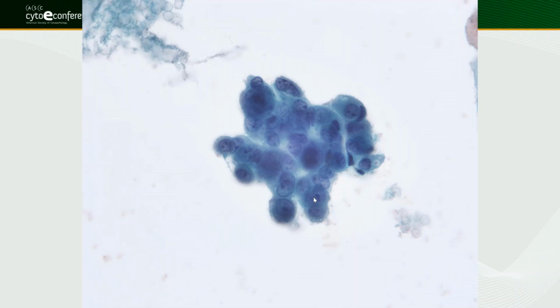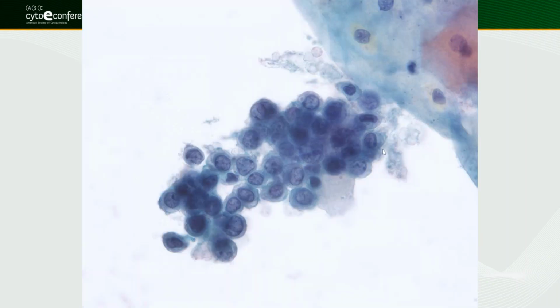So it clearly looks like adenocarcinoma, with irregular chromatin, very irregular nuclear membrane, macronucleoli, and some cells lined above there actually have targetoid mucin here, and another group of cells look more or less like this. This one actually didn't form three-dimensional clusters.